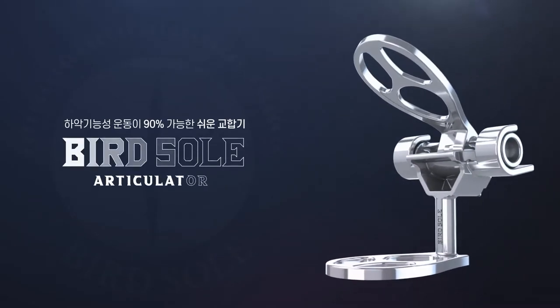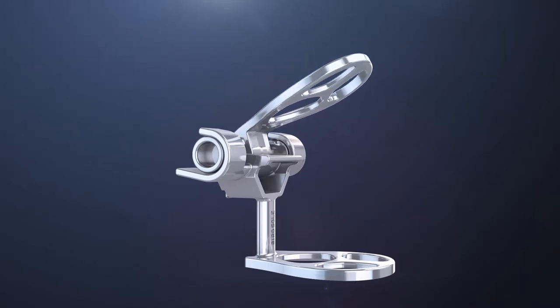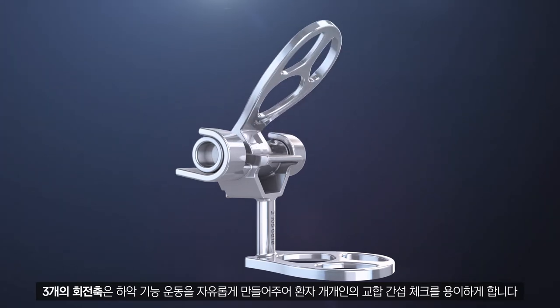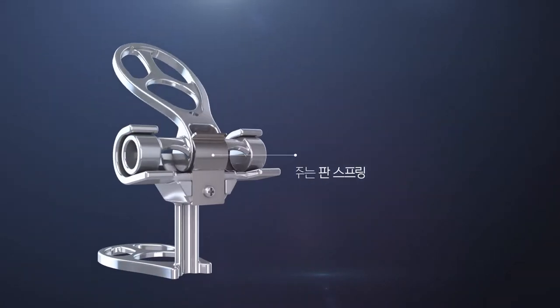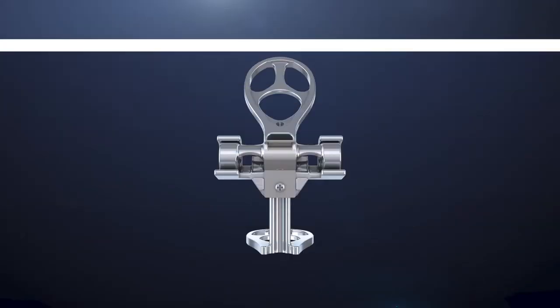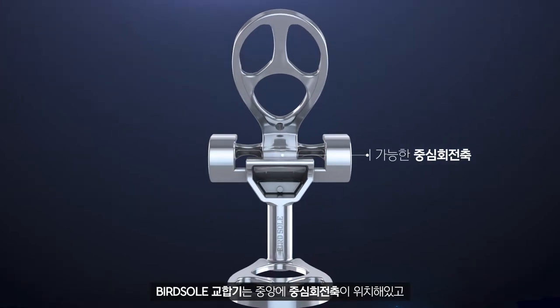The easy articulator enables 90% of mandibular movements. Three rotation axes enable free mandibular movements and help in checking occlusal interference. In each patient, the flat spring presents stability and helps with putting on and off easily.